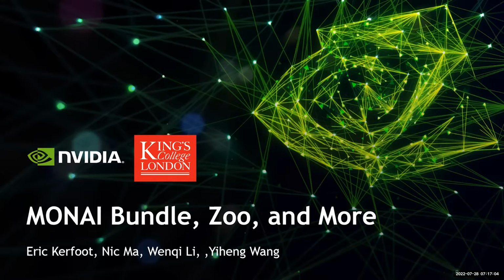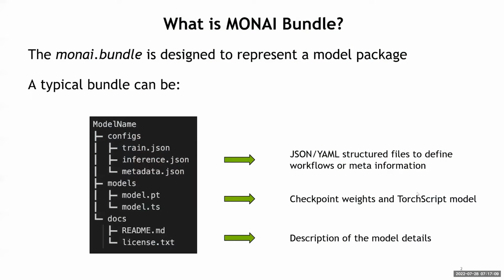So MONAI itself, of course, is a big library to help us do deep learning specifically with PyTorch. And so it's built on PyTorch to a huge degree. We are using a lot of the PyTorch ecosystem and building on top of that to provide some of the facilities that people need for doing specifically biomedical engineering AI research. So a lot of the data transforms and data loading, data handling, as well as networks and network components and loss functions and validation and some optimizers as well too. So there's a lot on top of that.